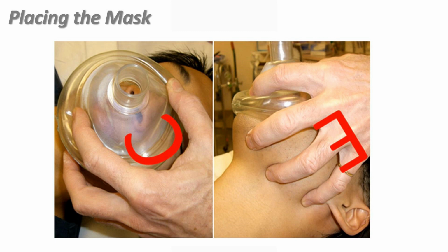Simple and easy. So in your little bag with your bag valve mask in it, make sure you've got at least a 20 cc or 30 cc syringe in there so you can make sure you've got air. That'd be the other thing to put in that program.